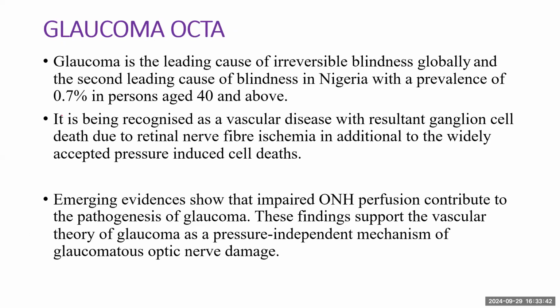This is about OCTA and glaucoma. It's noteworthy that glaucoma is still the leading cause of irreversible blindness, and we know the prevalence in our country. But OCTA became crucial because there are many theories of glaucoma. One of them is the vascular theory, which posits that glaucoma could be a vascular disease with resultant ganglion cell death due to retinal nerve fiber layer ischemia.